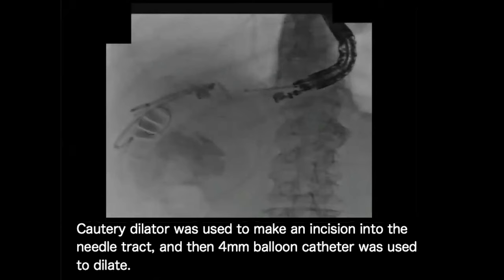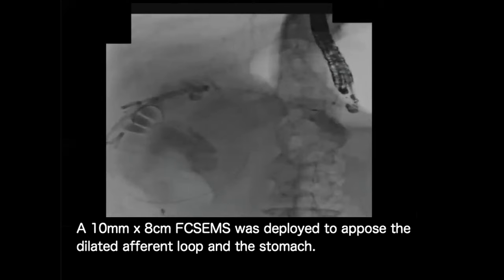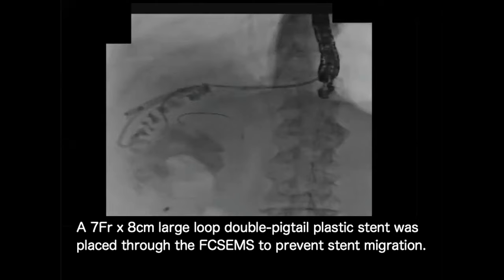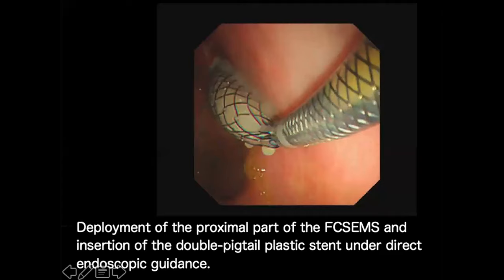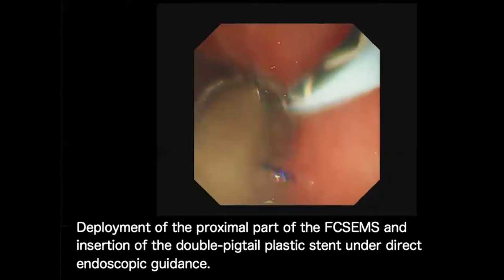A 10 mm by 8 cm fully covered metal stent was deployed to appose the dilated afferent loop and the stomach. A 7 French by 8 cm large loop double pigtail stent was passed through the fully covered metal stent to prevent stent migration, under EUS guidance and direct endoscopic guidance. Insertion of the double pigtail plastic stent.